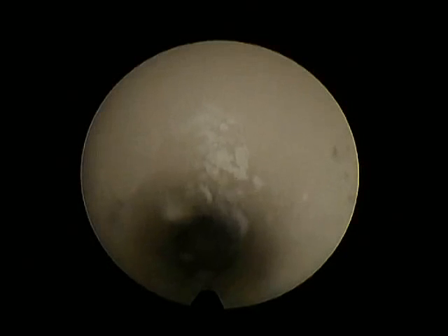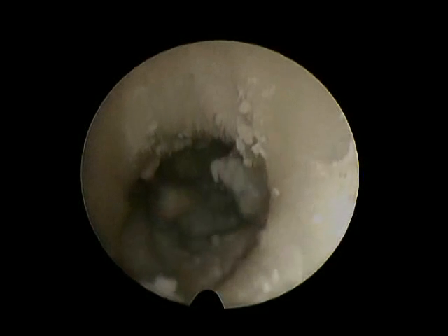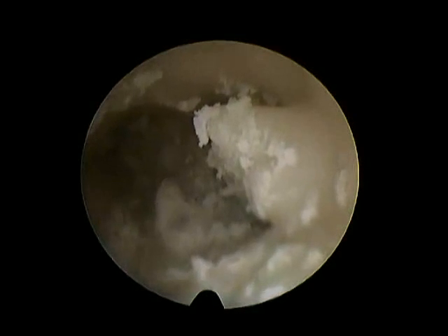We put the cervix at 6. This way we can penetrate it. We progress very slowly. We explore the endocervical canal. Slowly, millimeter per millimeter. And then we get inside the uterine cavity. We see multiple polyps, a big one at 3 in the entry. You see? And we see kind of a septate in the fundus. The right ostium is visualized by rotating the light cable to 3. You see there are polyps around.